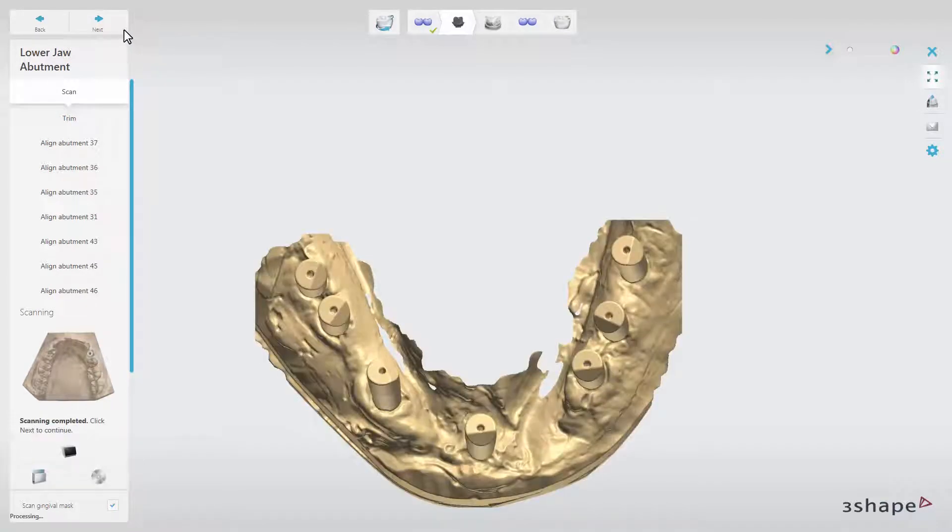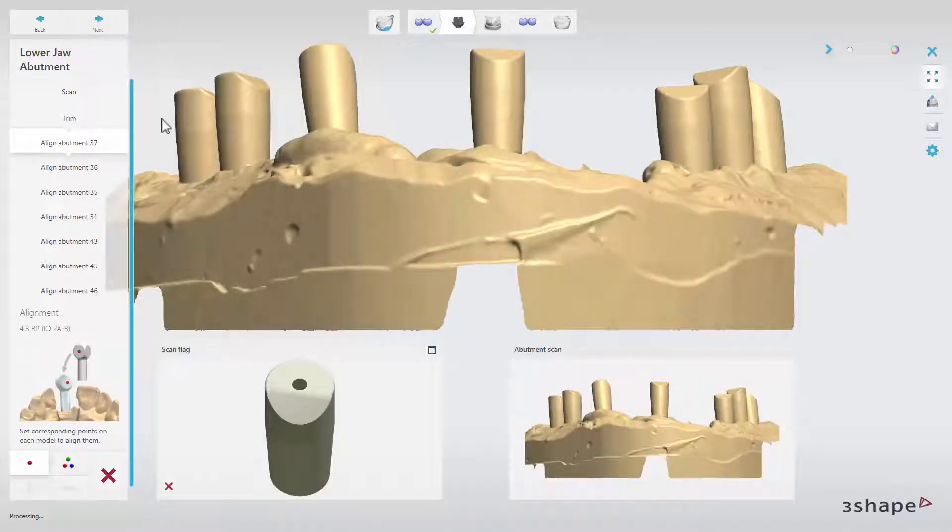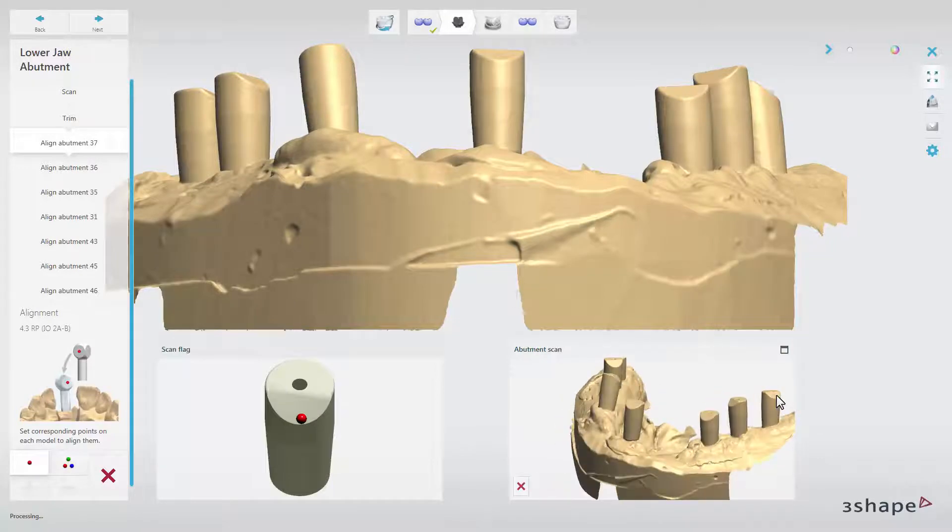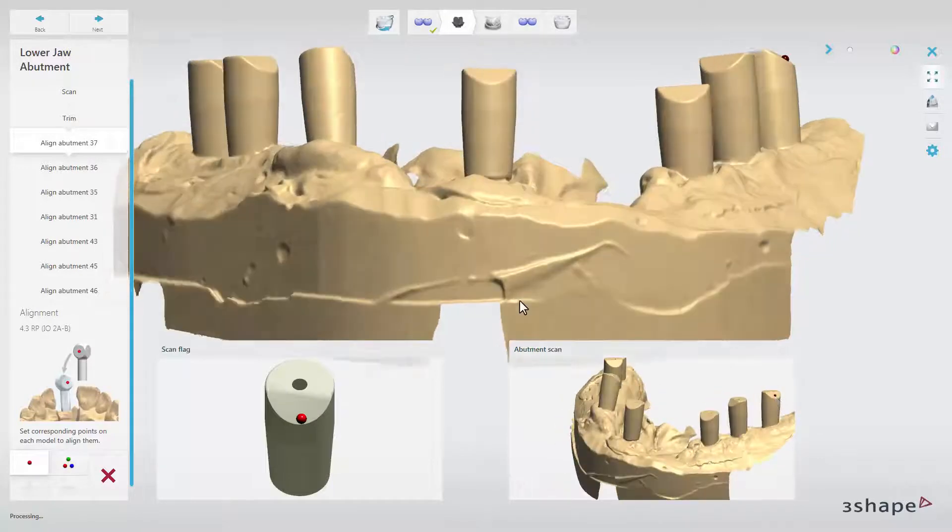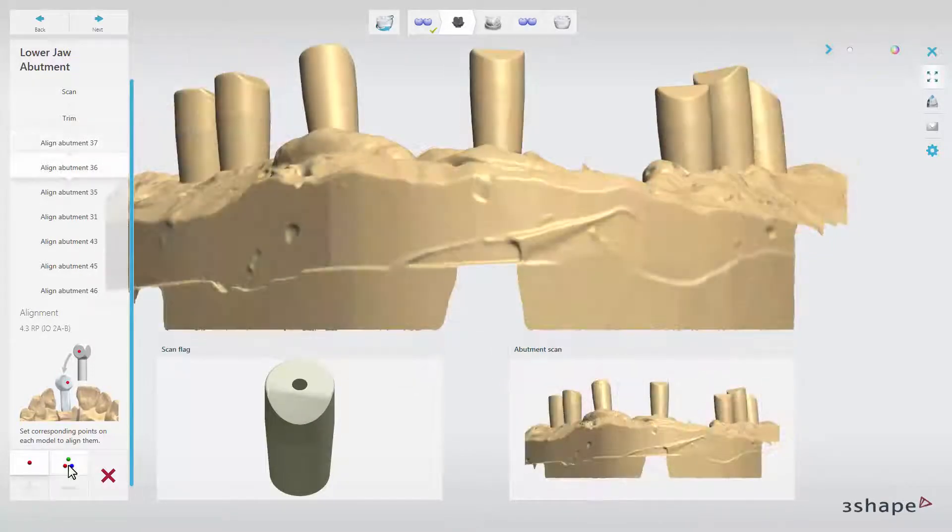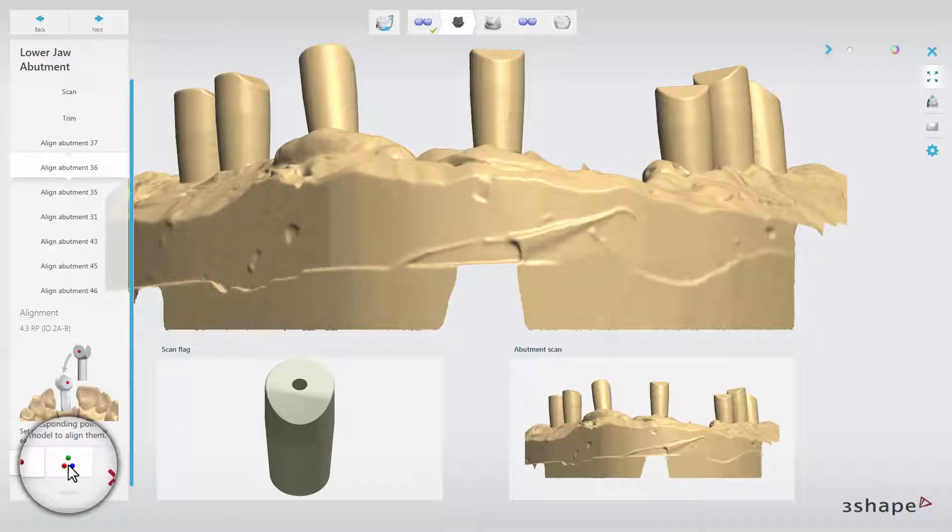When the model is scanned, click Next. At this point, you need to align all the system scan flags with the scanner abutments in the scan. To do that, you can use either one or three-point alignment.